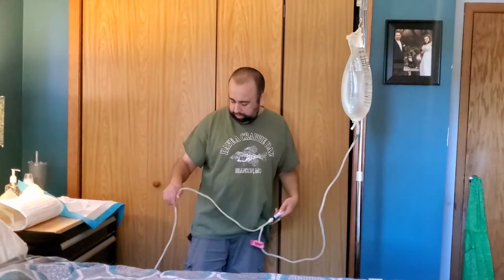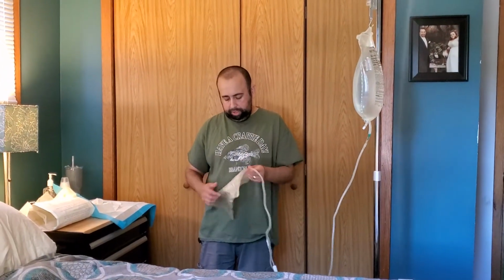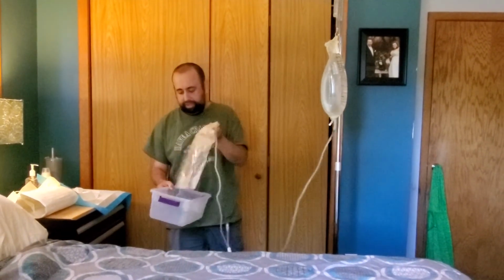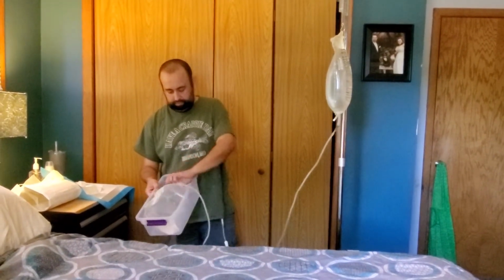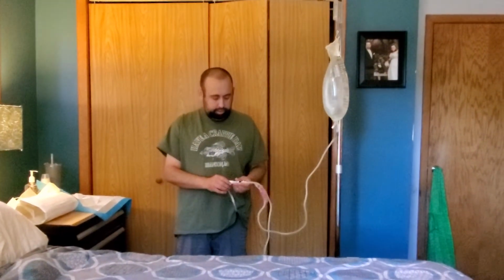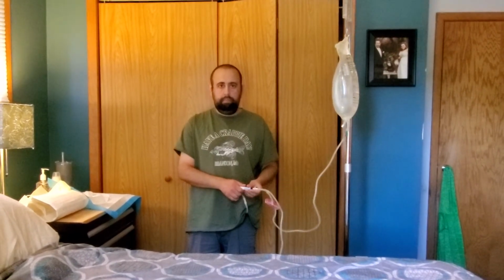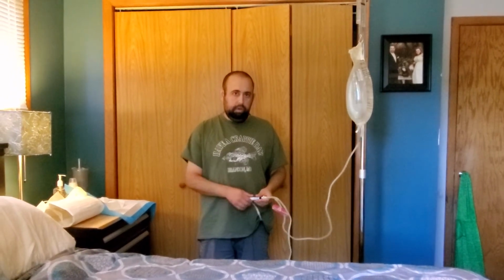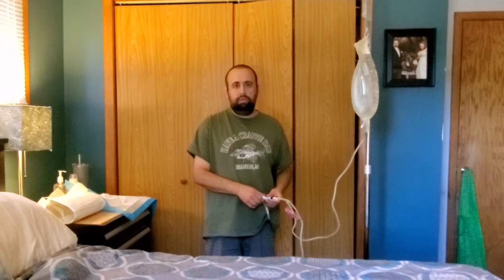So once we complete that, we get our drain bag ready. I've got a bucket that I put it in case it leaks. Leave that down on the floor, and then I can twist the end of this catheter to open it up. But you need to prime it first. I don't need to prime it until after I drain. You're doing the initial drain. I need to start with an initial drain, and then we'll continue on with the fill. So the initial drain just pulls out any extra fluid he might have put on since yesterday, or anything that might have been left from the day before.